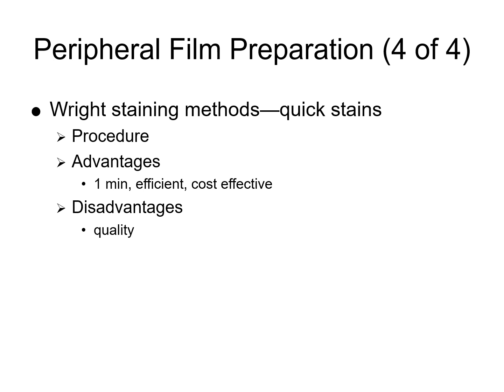Advantage: speed. It's completed in about 1 minute, which allows rapid processing of slides. It's efficient, so it's suitable for urgent situations where quick results are needed, and it's cost effective. It requires fewer reagents and less time, which makes it economical for high volume labs.